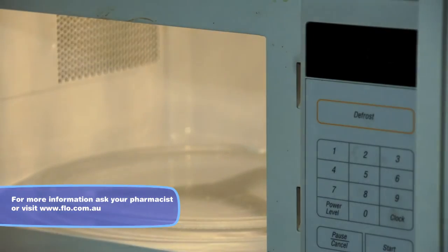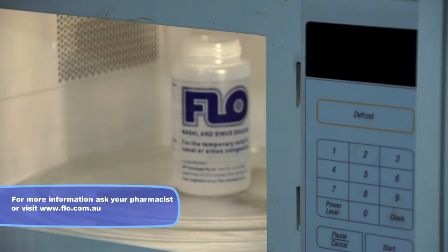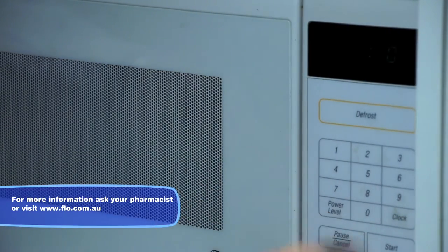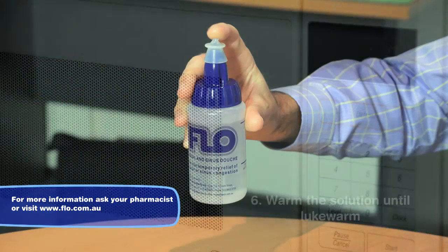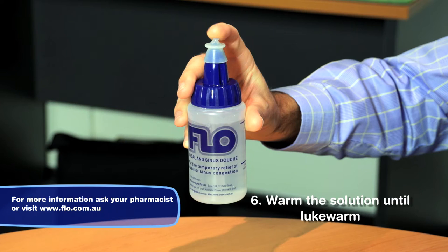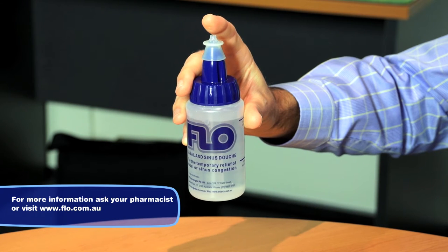You may then warm the bottle in the microwave oven for about 10 seconds until it becomes lukewarm. If you're using previously boiled water that has been stored in the refrigerator, you may need to warm the solution several times until it reaches the correct temperature. The device is now ready for use.